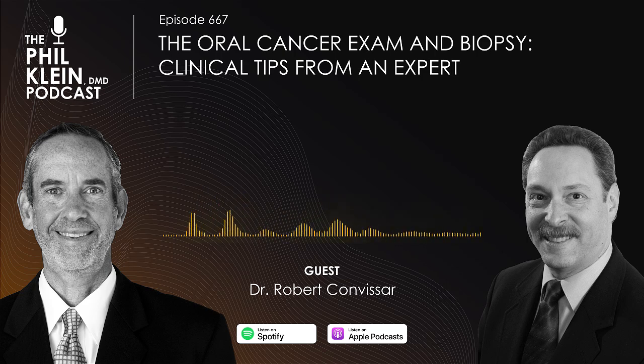And in the simplest terms, the way this thing works is that if it's green, the tissue is emitting a green fluorescent color, that indicates healthy tissue. And when it's dark, then there's something going on. It could be dysplastic. There could be some unhealthy activity going on at the tissue level. Is that correct? Is that right? Exactly. It gives you an idea that something's going on.